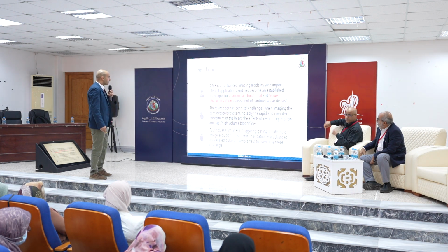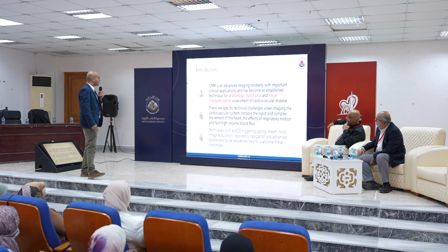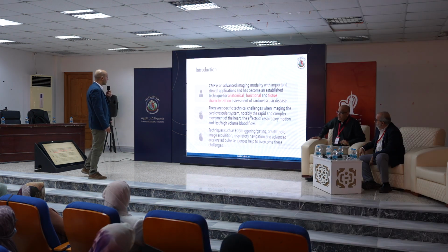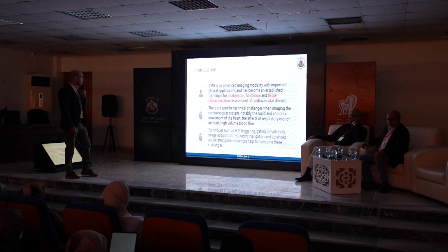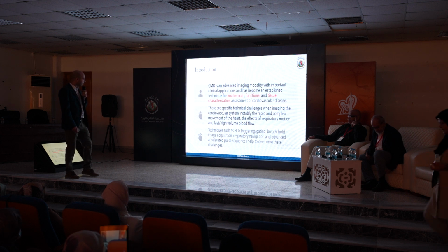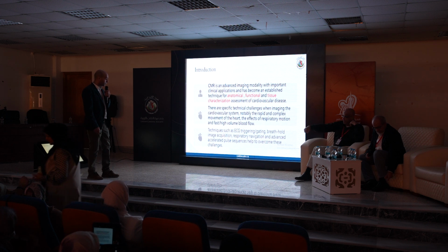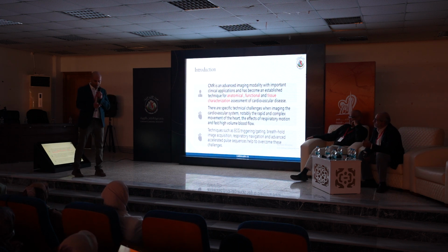There are specific challenges with the imaging of the cardiovascular system, notably rapid and complex movements of the heart, the effect of respiratory motion, and fast high volume blood flow. Techniques such as ECG triggering, gating, breath hold imaging acquisition, respiratory navigation, and so on help us to overcome these challenges.